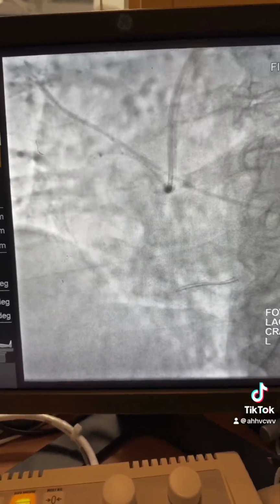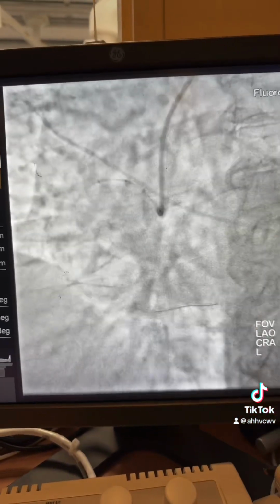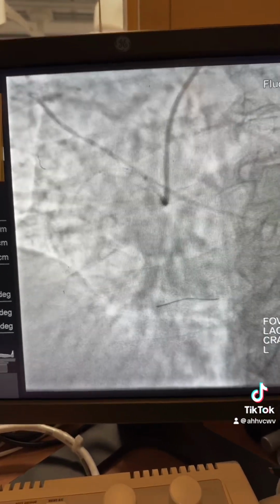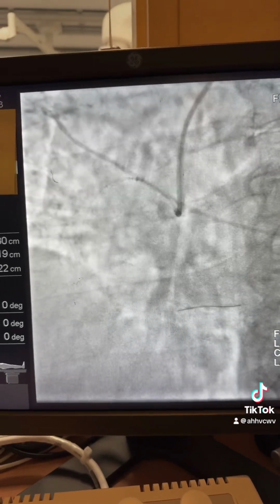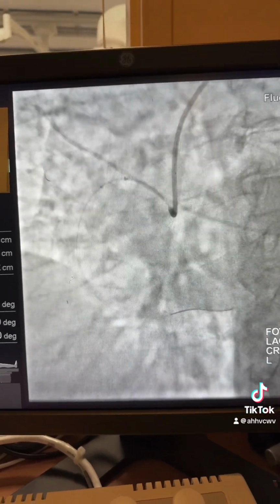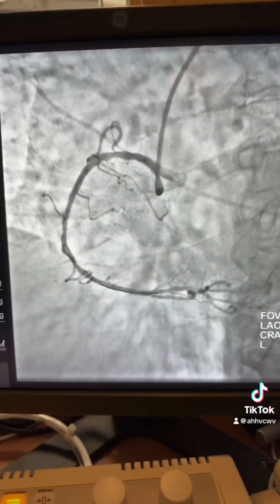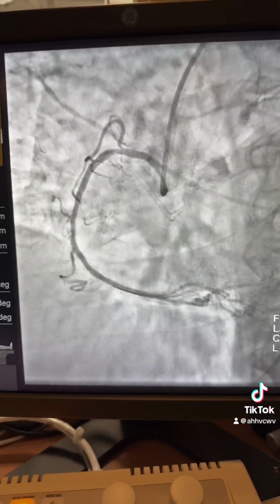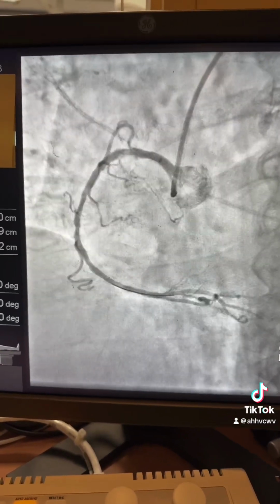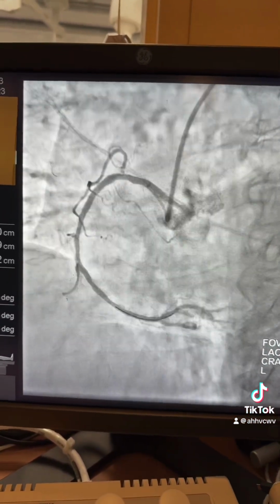Always, before pulling the balloon or the stent balloon, make sure you advance the GuideLiner to swallow the balloon and place it in a nice spot with nice room to have a good waveform for the pressure, especially in this case when you have no good support from the guide. Now here is the angiogram after the Shockwave, which is a very decent result. Next we'll stent the distal and then the proximal.